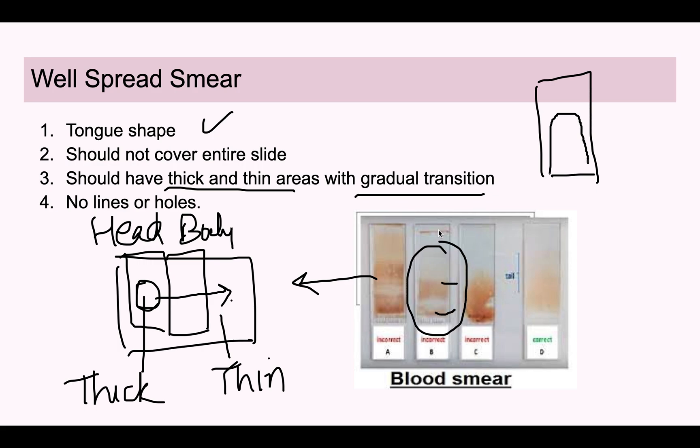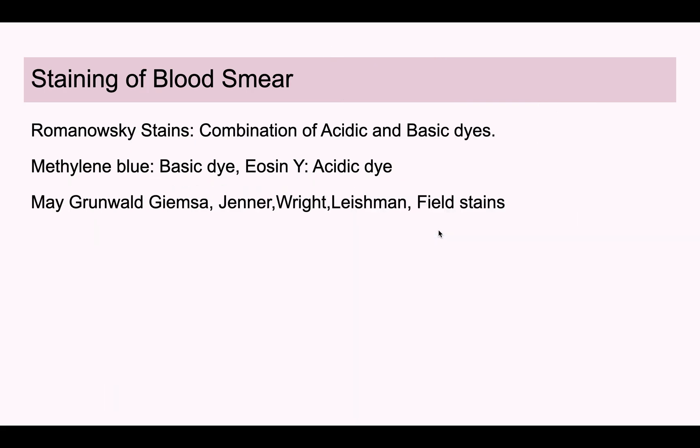A well-spread smear should not have abrupt transitions — thick area, thick area, then thin area is not acceptable. There should also be no holes or lines in the smear. To avoid this, the spreader should have smooth edges and should not have jagged edges.